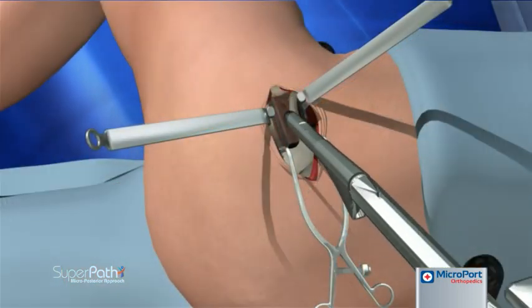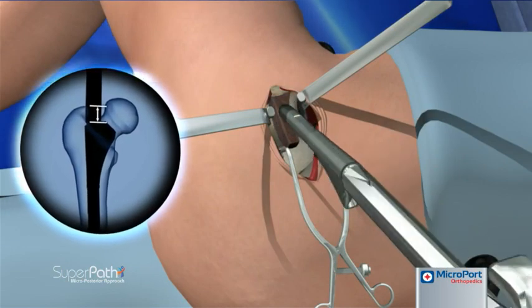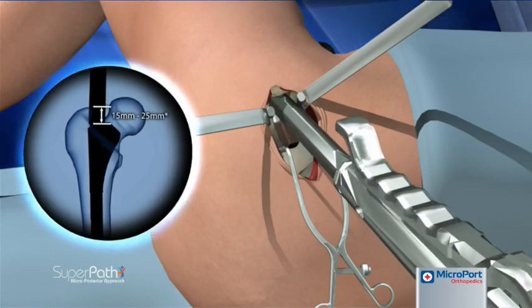The femoral canal is prepared according to the selected stem, using either a ream and broach or broach-only technique. After sequential broaching, the final broach is left seated within the canal.